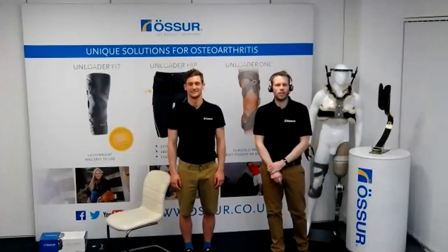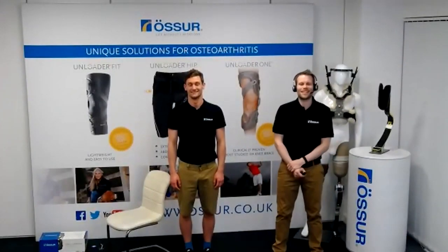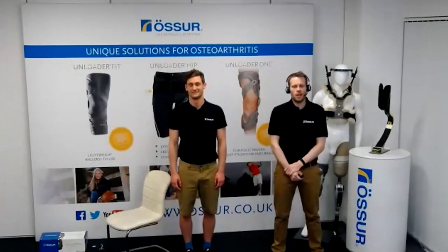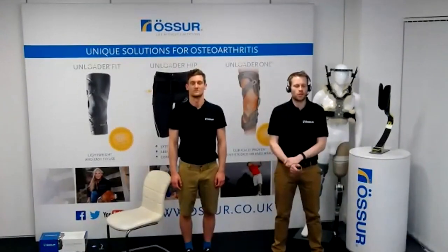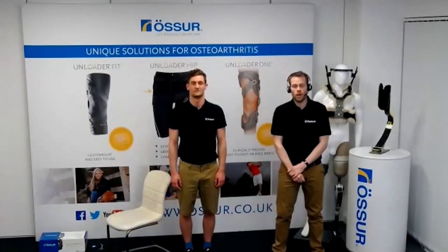Good evening and welcome to the Össur Unloader 1 advanced fitting webinar. This evening we're going to go through the sizing and application of the unloader, along with tips on accessories you can use to solve common problems and hints as we go along, to ensure a really good fit and the best outcome for your patient.